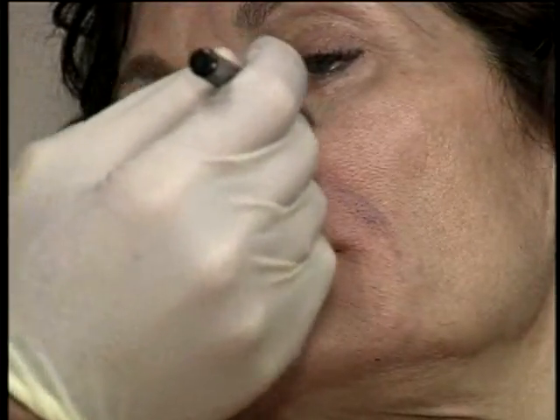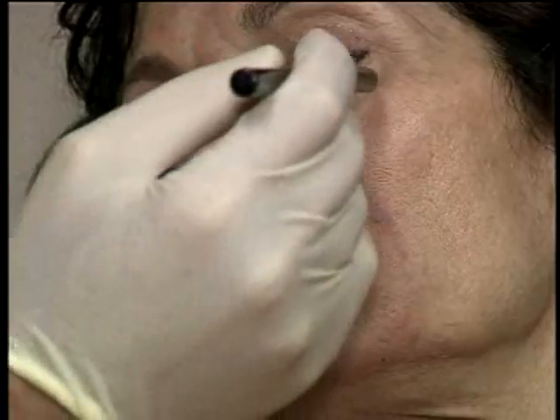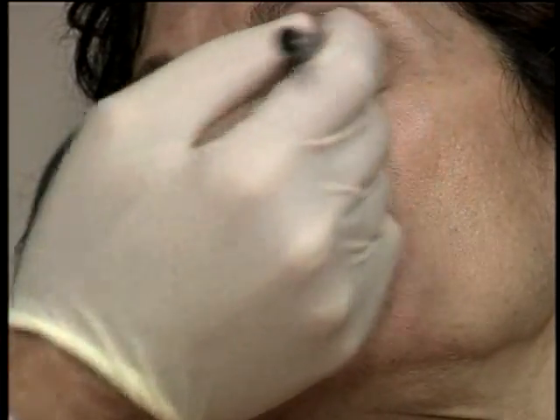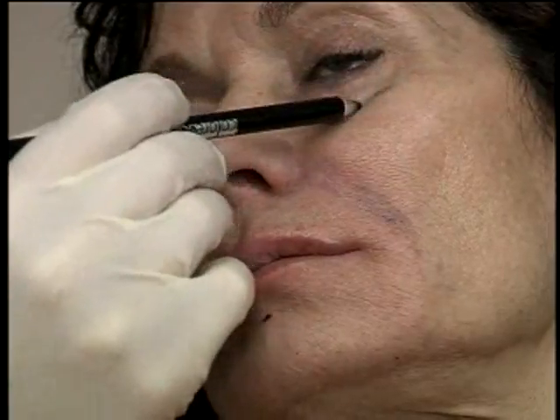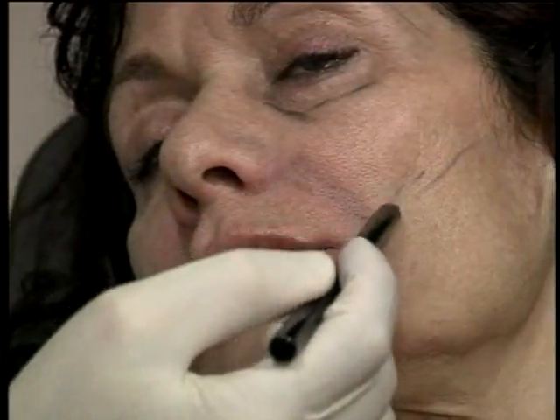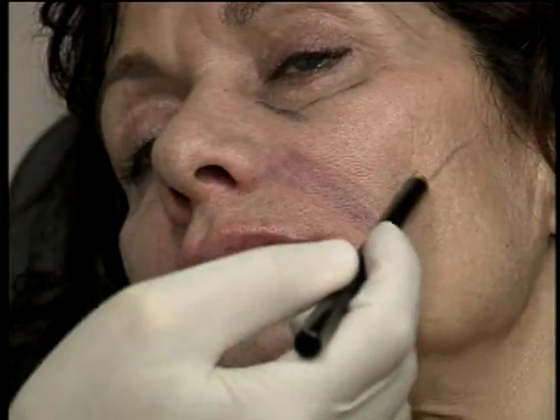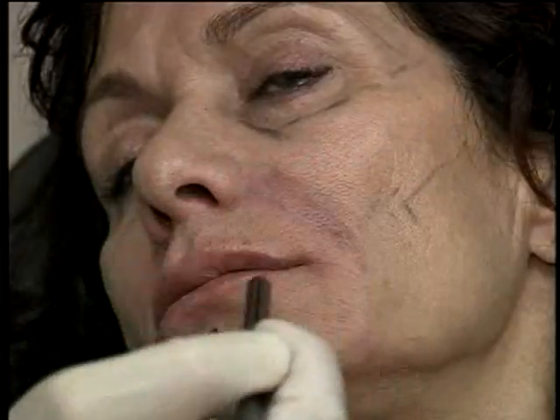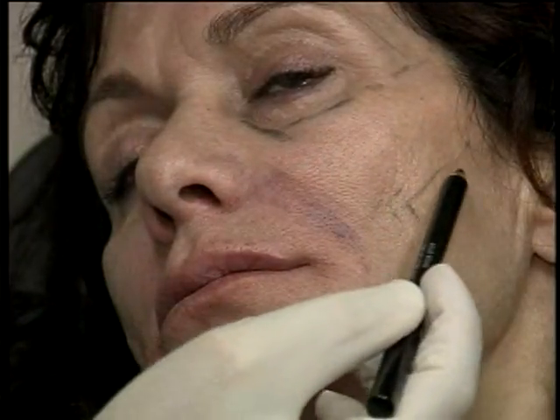Here's the nasojugal groove, an infraorbital hollow through here. I'm going to draw the infraorbital hollow, and then this is an area of the cheek that we may try to accentuate, but fan it into this area.